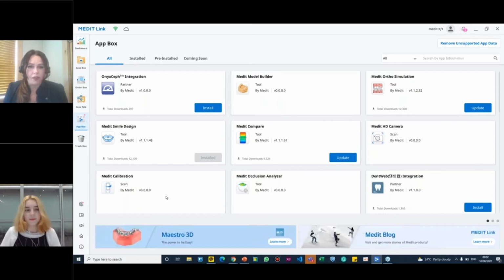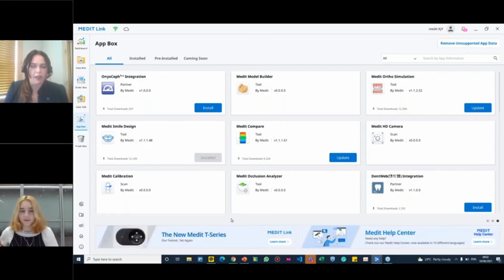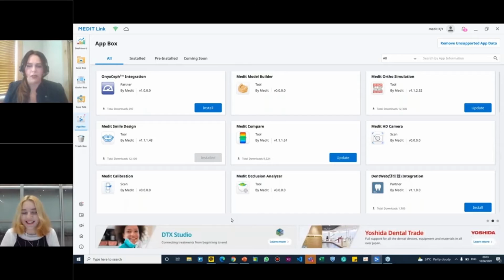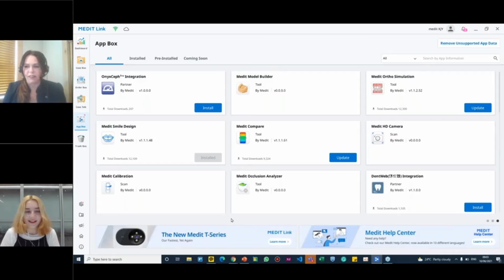We're going to focus these webinars on the clinics and the laboratories. Right now, June is going to be, thanks to Maria, Medit App Month. In the US and Canada, we have been bombarded with questions regarding these apps. Everybody's really excited about them and they want to know more about how to use them. Who better to have teach us than Maria, someone who's been there from the beginning.